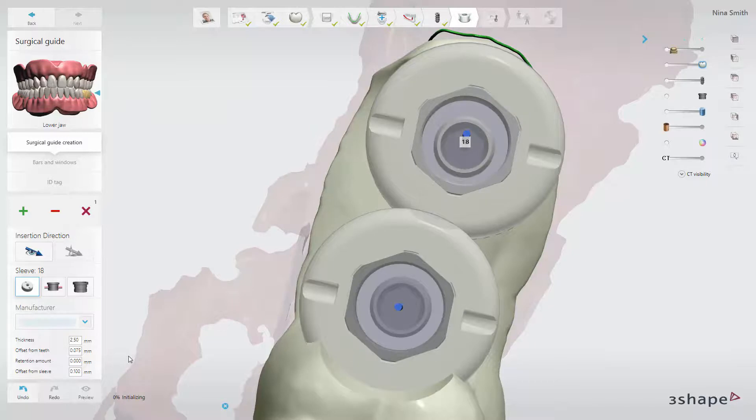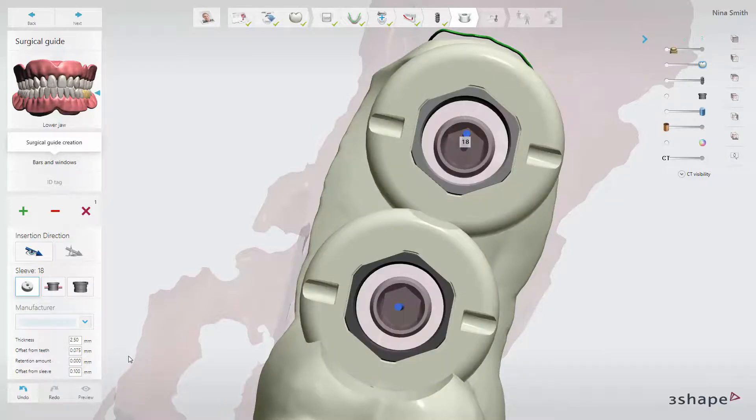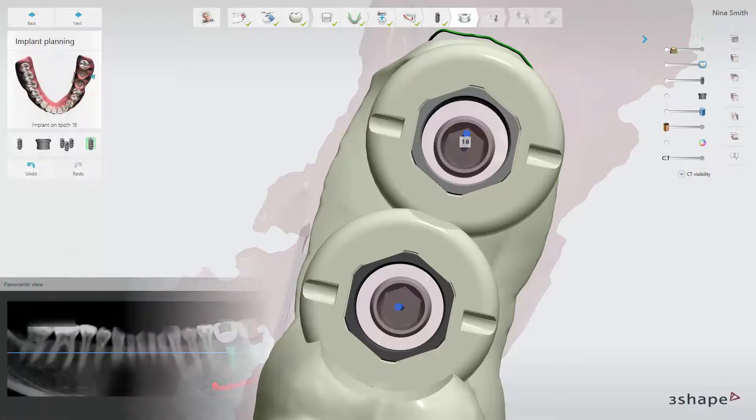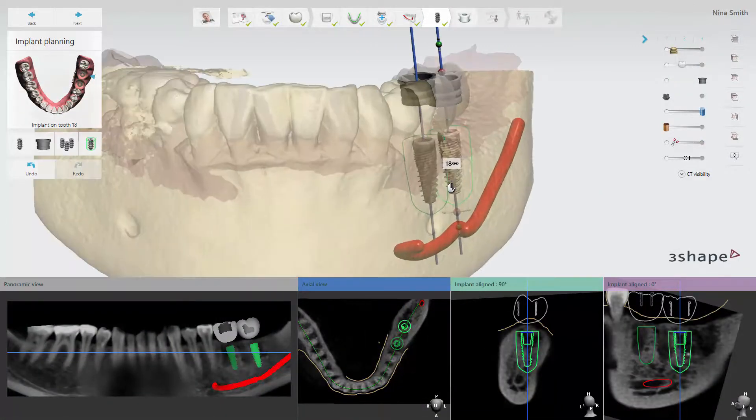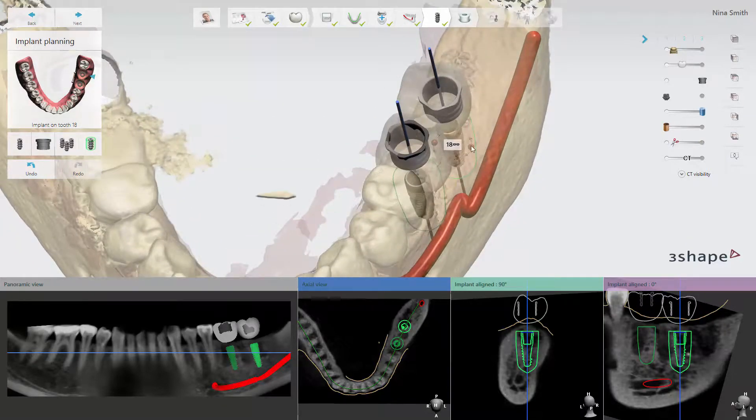By default, the orientation mark will be positioned perpendicular to the panoramic plane. When the implant is being rotated around its axis, the orientation marks will repeat the rotation of the implant.